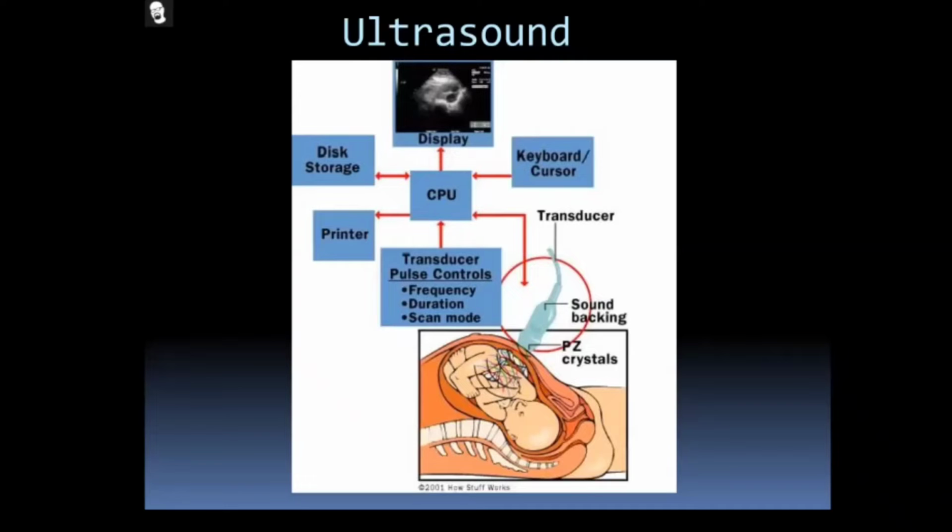The received ultrasound waves are computerized with the help of reconstruction software and some other software, so we can build 2D images, 3D images, and even 4D images. Nowadays we can see these using the ultrasound machine. Mostly, ultrasound is used for fetal ultrasound. About 72% of ultrasound is used for fetal purposes. That is what I needed to say.